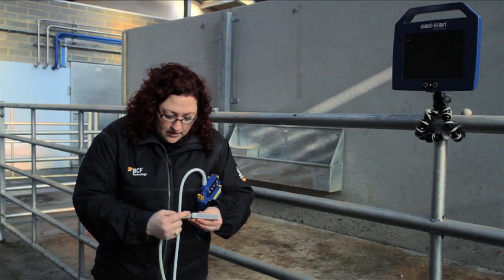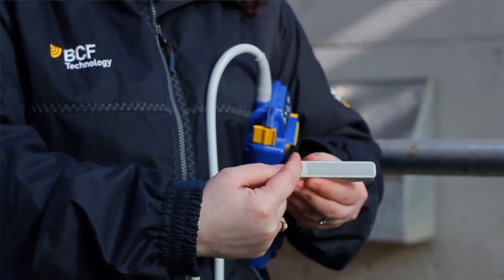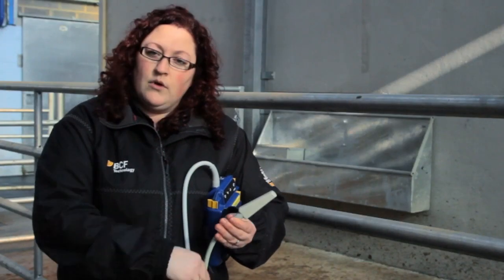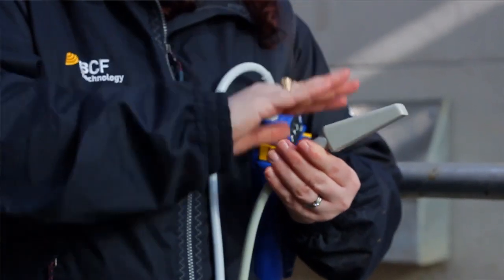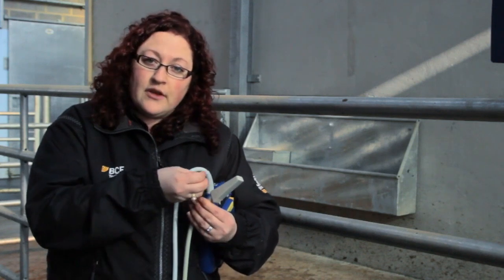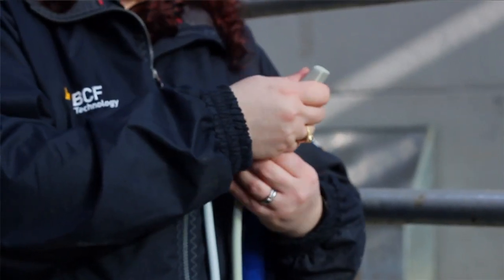On the ultrasound probe, this is a rectal probe, which is a linear probe. And what that means is you have ultrasound crystals, which are located along the face of the probe here. Electricity runs down this cable and causes these ultrasound crystals to vibrate. When they vibrate, they release an ultrasound wave, which then travels down into the tissues, bounces off of structures, and is returned back to the probe.